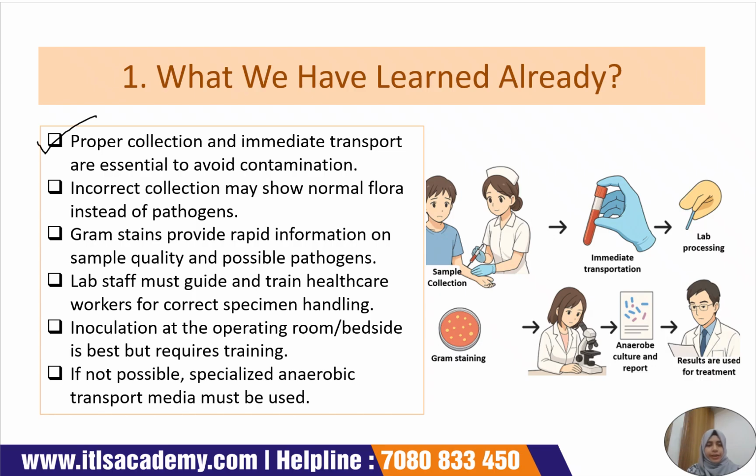So the first point here is specimen must be collected correctly and transported quickly to the lab. Delay or improper handling can lead to contamination with unwanted organisms. Now, the second point, if the sample is collected incorrectly, the lab results may show normal flora rather than the actual disease-causing pathogens. Third one, what we have learned is Gram staining gives fast information about whether the specimen is appropriate and what type of potential pathogens may be present.